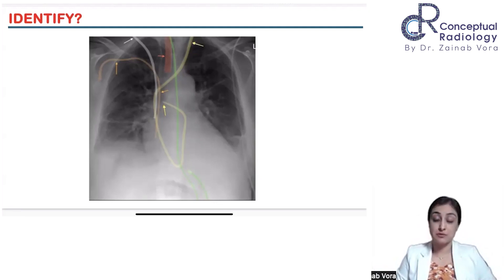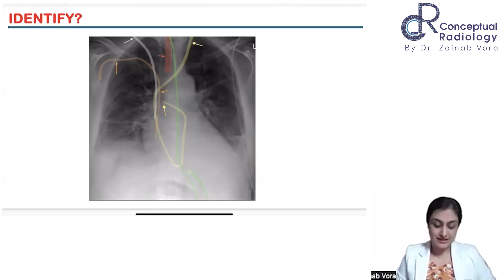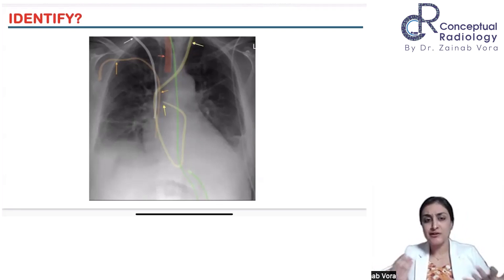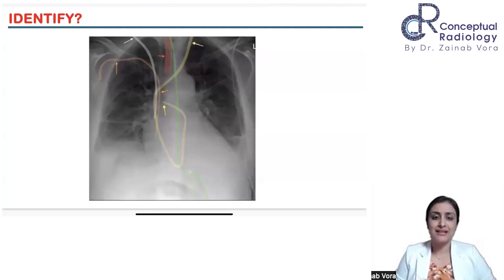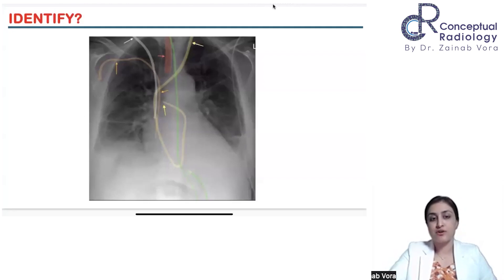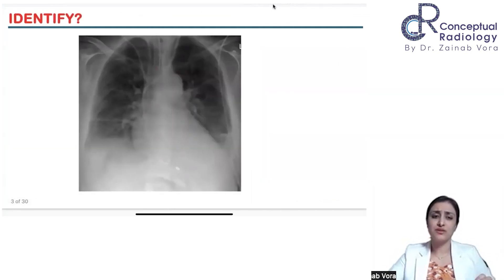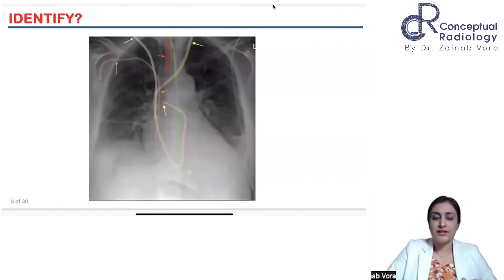The chemoport is not the same as a permacath — a permacath is a tunneled catheter. This patient also has associated findings of probable cardiogenic pulmonary edema: fissural thickening, bilateral pleural effusion, and cardiomegaly. So many lines together usually means a very sick patient.